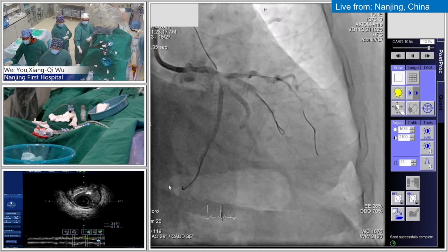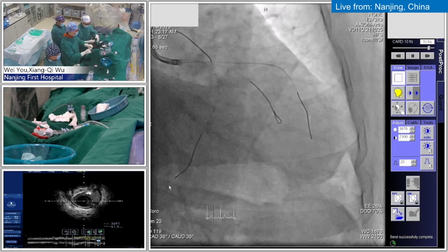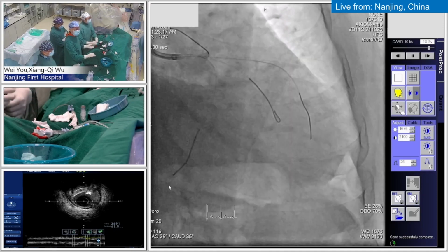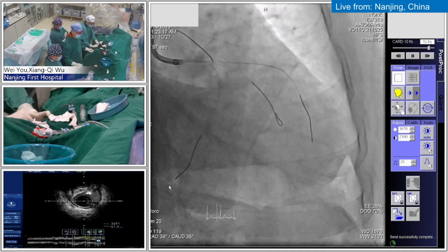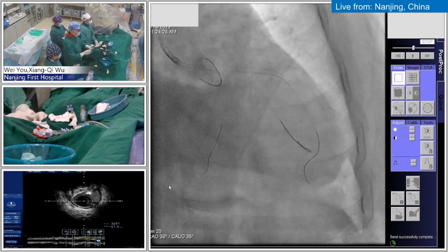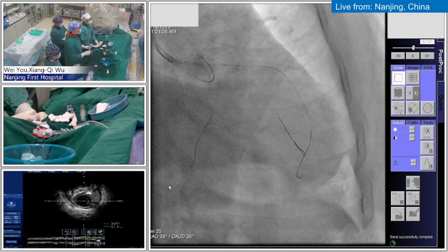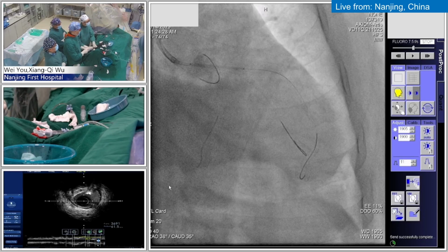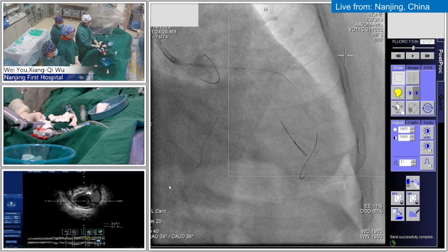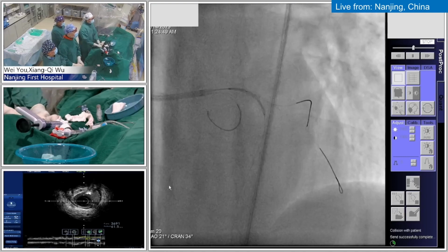So much of that, when you are stenting, depends on having excellent stent apposition, verifying it with imaging. Often people are using more and more routine IVUS or OCT guidance. I can tell you that its biggest role in my mind appears to be to document the final result, and that is where I think comes its largest role, whether you need to do further balloon dilatations or take other steps for stent expansion. Beyond that, of course, our approaches of risk factor modification, the role of statins, and some of the other newer modalities, which we may get a chance to discuss further.